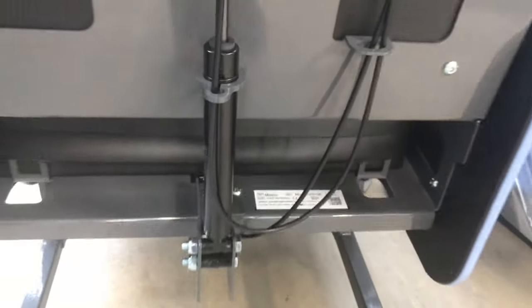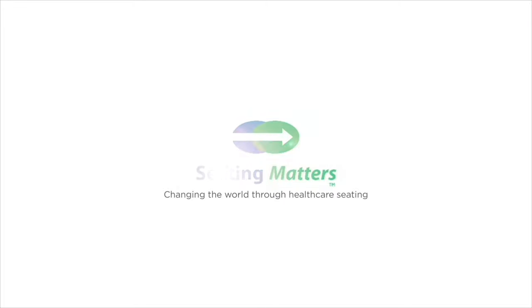It's really visual, really easy to see, and this is how to locate the serial number on the Seating Matters chairs.